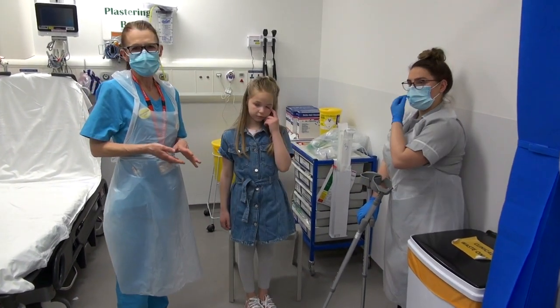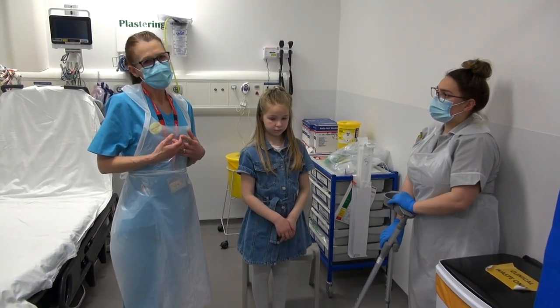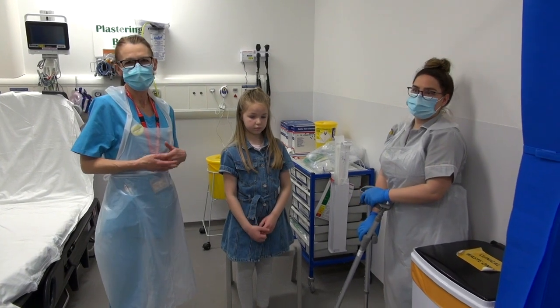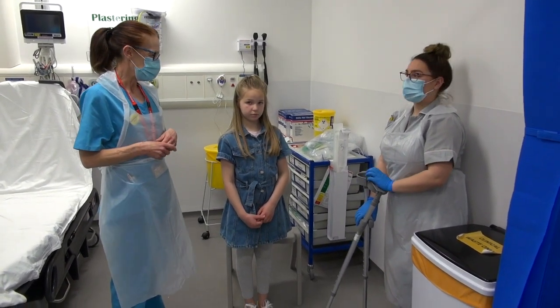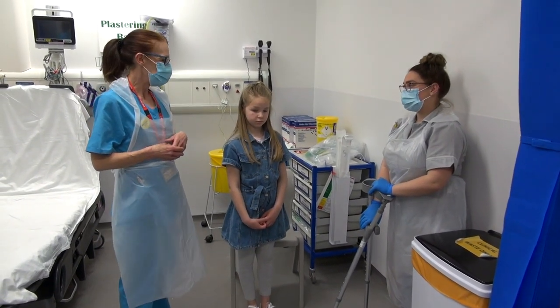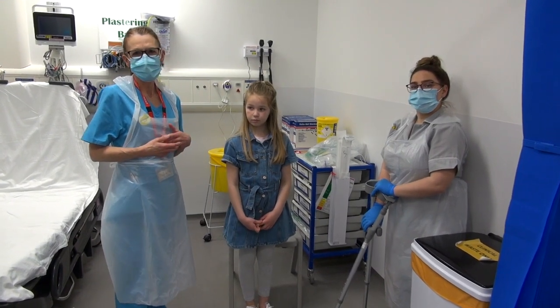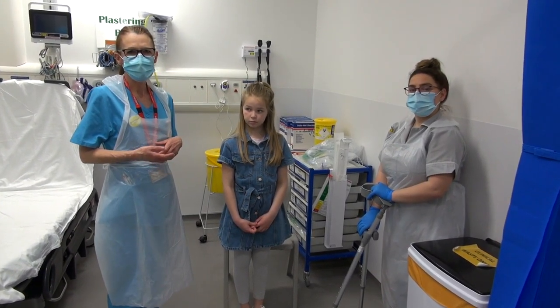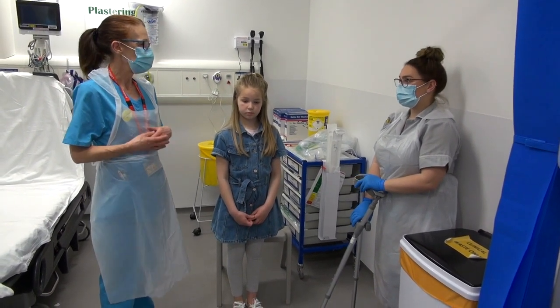They've got to always be safe at home and confident in using the crutches. They need to not go up and down stairs using the crutches — if they need to go upstairs, they need to go on the bottom and come down the same way. It's also important how you advise people to get in and out of a chair. Good lighting in your home and removing any rugs that might be in the way to prevent trips and falls, and any slippery floors as well.